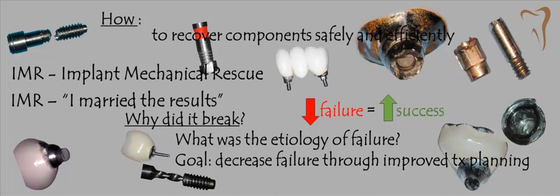But this area actually is out of the scope of the presentation, but I want to make one point. If you're not used to doing this, be very careful with going into that implant, especially with rotary instruments, because it can get out of hand real fast. And all of a sudden, IMR becomes something else, and it's called I married the results. So you don't want to go down that road.